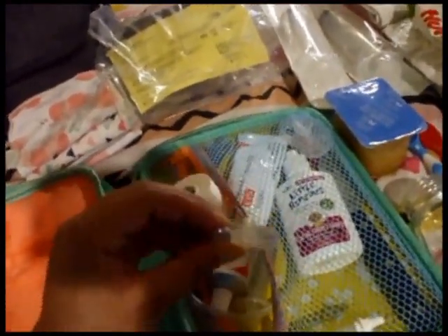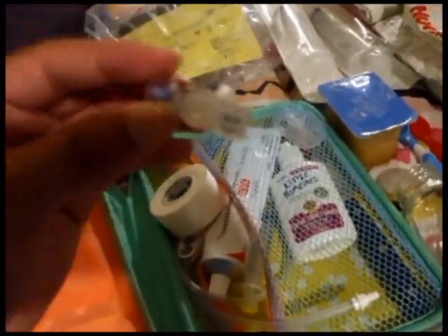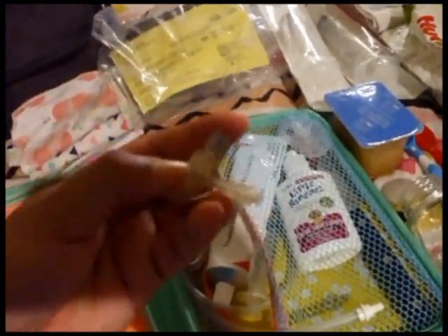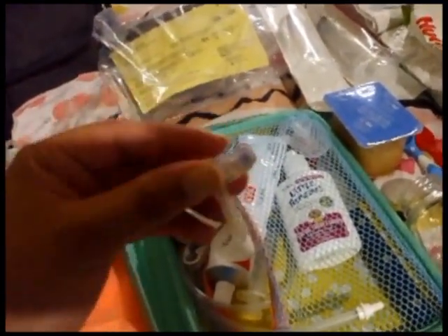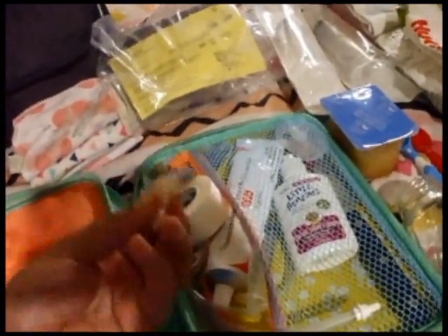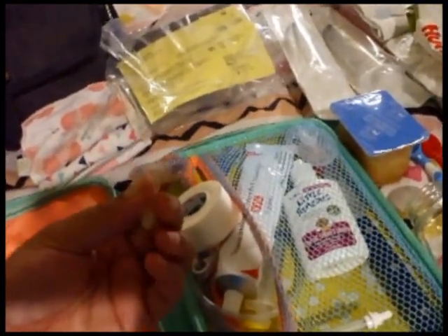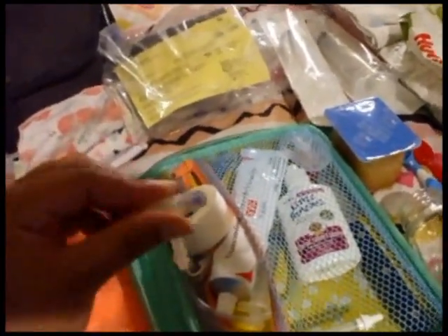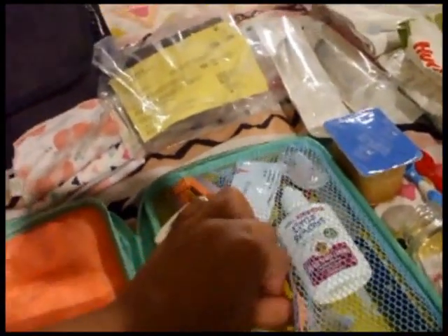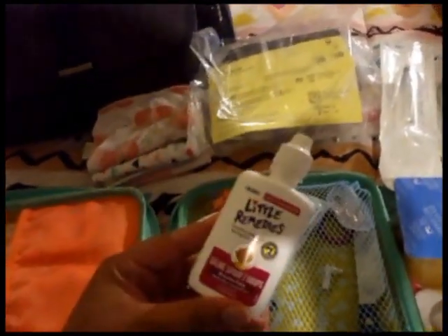And this, I do not use this, but this is actually what her G button looks like. I just normally keep this. People are curious. They always ask me how does it look, so I just keep one of these in here to show people, or if I'm demonstrating to her dad or my mom or his mom what to do if it ever comes out. This is a demo button that I use for them to be able to see what to do. I also keep some saline drops.